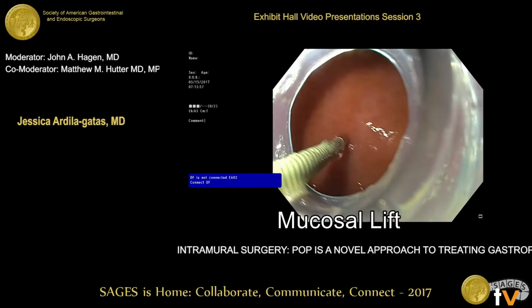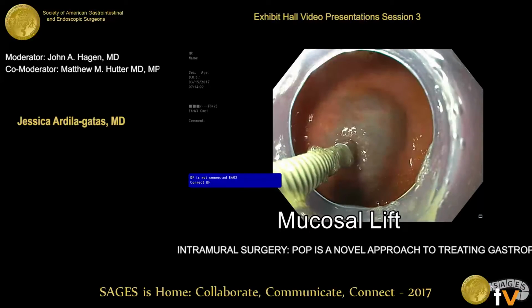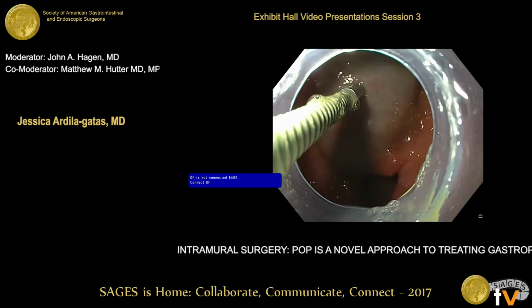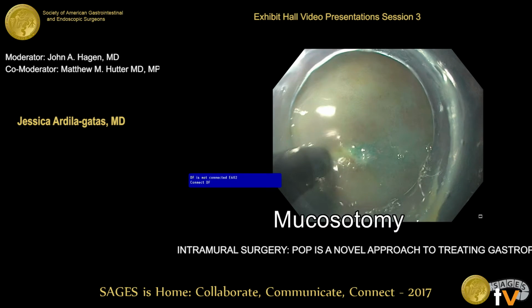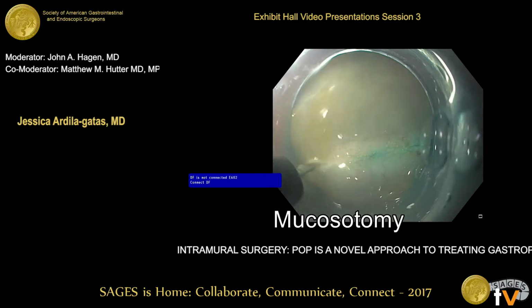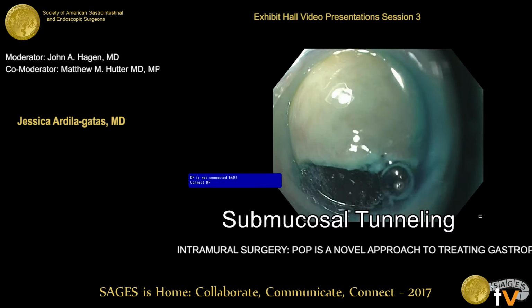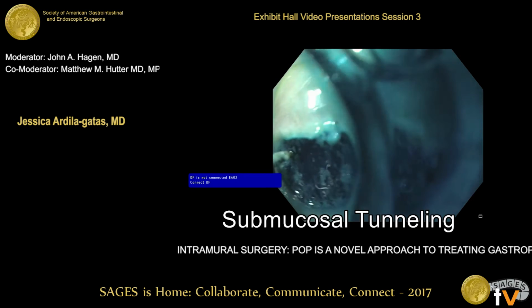So the surgery starts with injection of the submucosal plane with methylene blue and epinephrine solution to raise the mucosa from the submucosal plane. We do this just proximal to the pylorus along the lesser curvature. Then we create a mucosotomy using a TT knife and electrocautery, a transverse mucosotomy. Using the tip of the knife and the endoscopic dissecting cap, we deflect the mucosa downwards to get access to the intramural space.